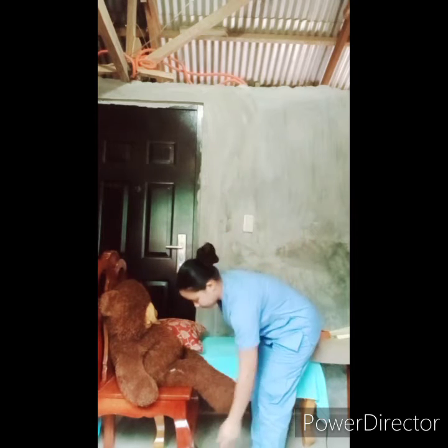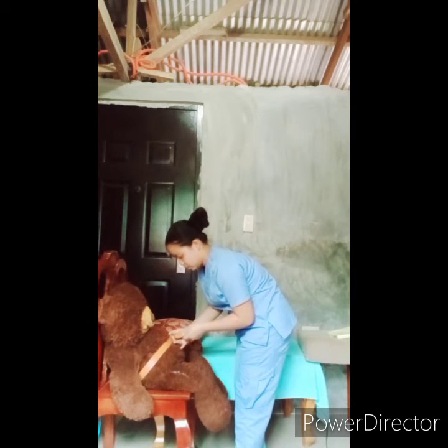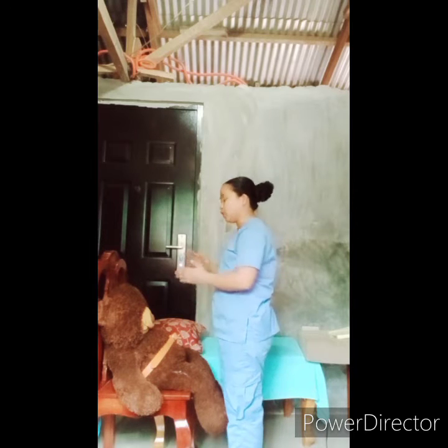Next, let's lock the wheelchair, and let's raise the foot plates. Next, let's place the transfer belt on the patient appropriately. After we place the transfer belt, let's assist the patient in placing the hands on the armrest and move to the front of the wheelchair. Next, let's stand in front of the patient, then protect the patient during transfer.